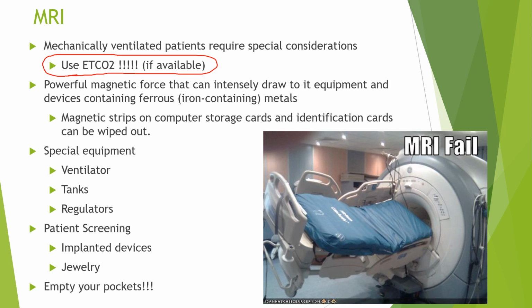If you have the ability to use end-tidal CO2 in an MRI situation, I would say use it. I don't see any reason currently why you would go wrong in that situation. That's my own bias, and I hope I sold you on it. You'll be your own practitioners, but I want you to see how valuable this is, both as a cardiac and pulmonary evaluation of your patient. I'm a huge fan of end-tidal CO2, and we'll go into it in the future as well. I hope so anyway.